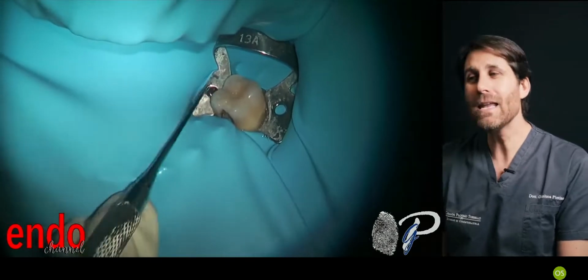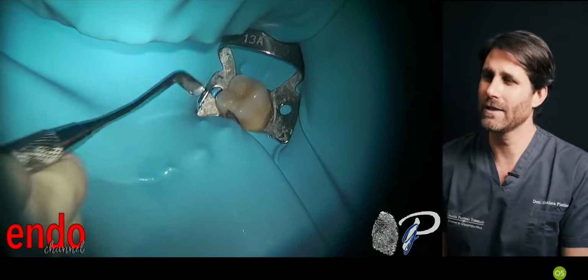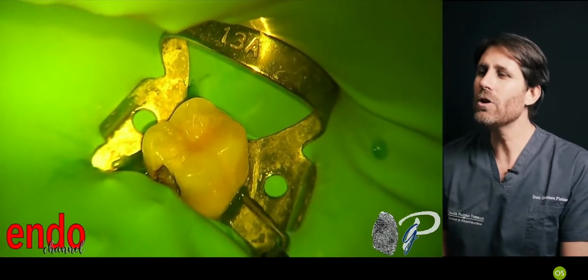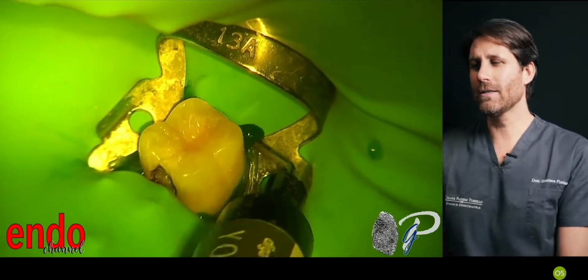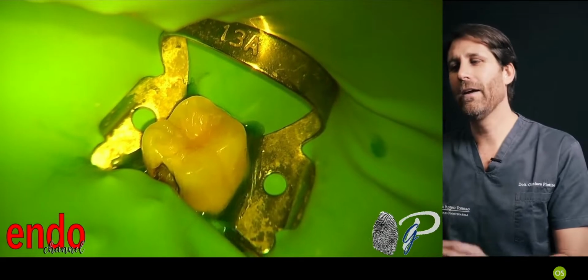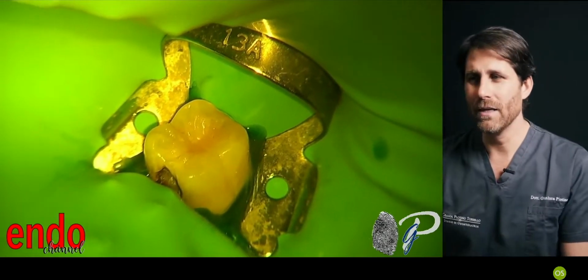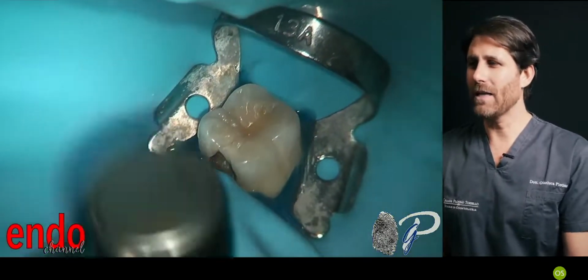From the beginning of the treatment, I like to use rubber dam before opening the access cavity, with some exceptions, and use liquid dam, Teflon, everything in your hands to improve the isolation of the field. Rubber dam alone does not mean isolation, but all these accessory materials help us to isolate.